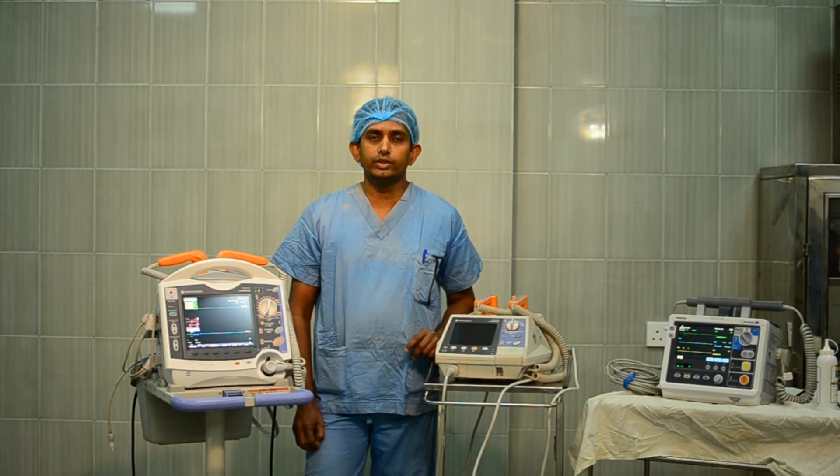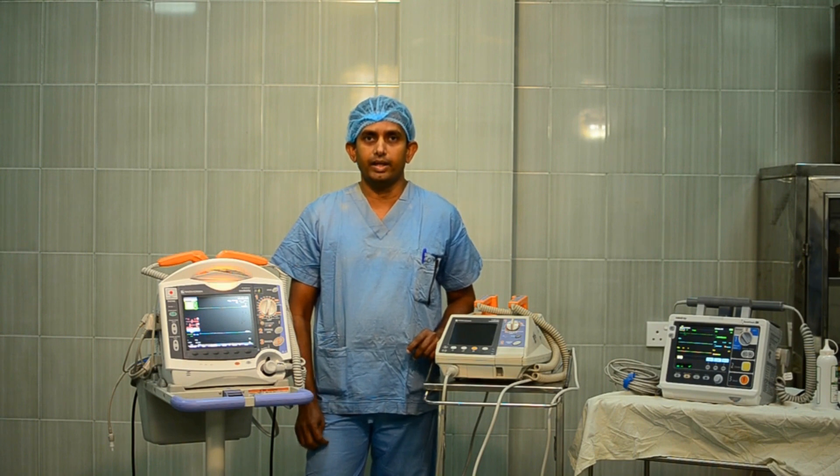This demonstration shows how to use a defibrillator safely and effectively without adhesive pads.